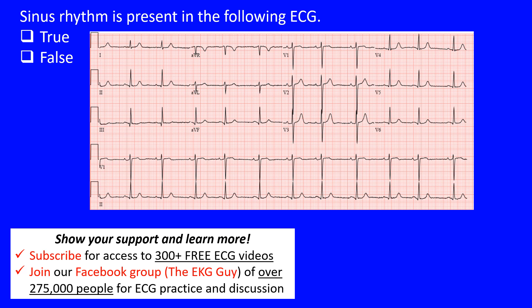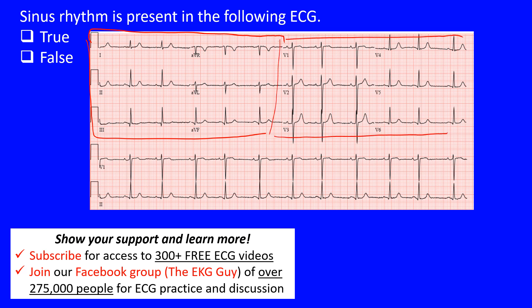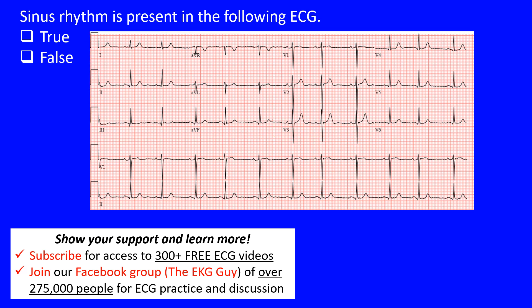Here we have a true or false question: is sinus rhythm present in this ECG? We have a standard 12-lead ECG with six limb leads on the left side and six precordial leads on the right, plus two rhythm strips — lead V1 and lead 2. The standard duration is 10 seconds from beginning to end.